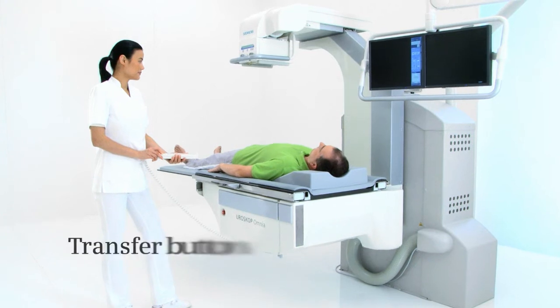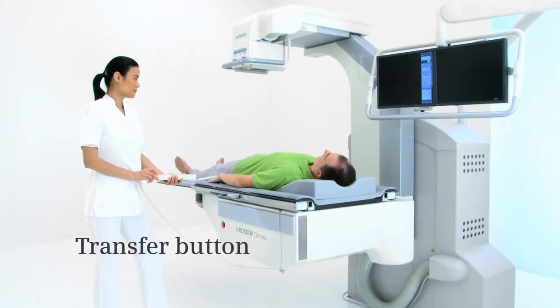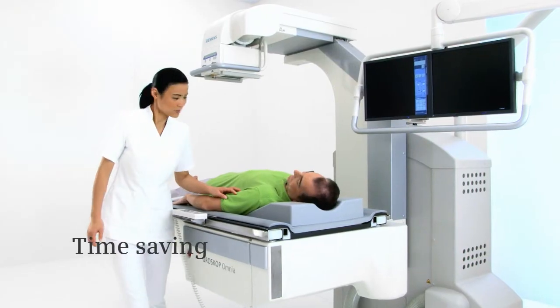With a single push of a button, you can move the system from the patient transfer position to your working position, saving precious time.